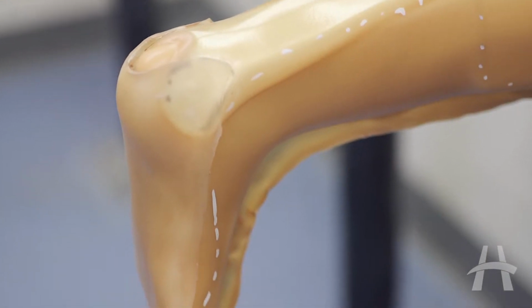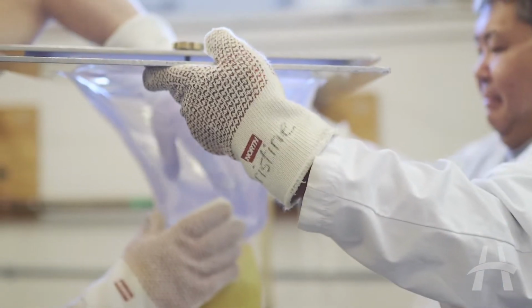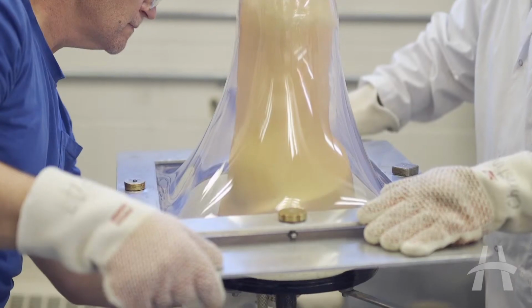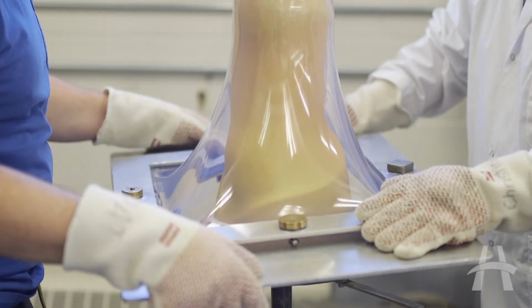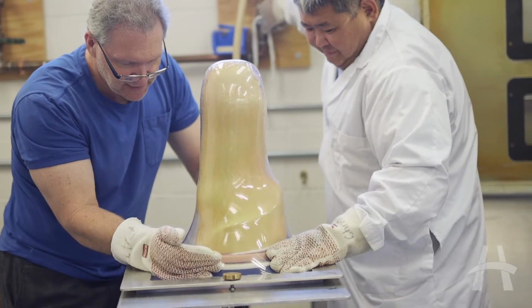So basically we have probably 15 or 20 different kinds of plastic that we use. This will be a flat sheet when it goes into the oven in about 6 minutes. It's warm enough to mold around this. And the vacuum station will actually suck all the air out, and it shrink wraps the plastic around the mold. And we'll have this exact replica as the inside shape of the mold.